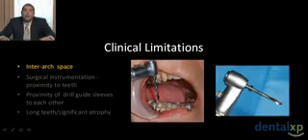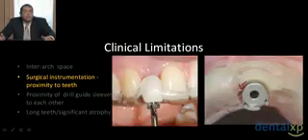And then there are strategies to overcome some of these difficulties, whether it's placing the burr into the surgical guide before you put it inside the patient's mouth, although that can be somewhat difficult. Having the patient close before you place this burr to have the muscles relax so they can open wider. Or sometimes we just need to use a shorter burr, pilot the osteotomy to give us location and angle, and drill to final depth without the surgical guide in place. But again, we should be evaluating our patients prior to fabricating these types of guides to see if they will actually be usable within our patients.